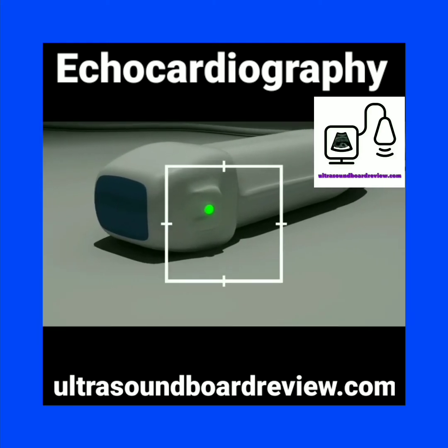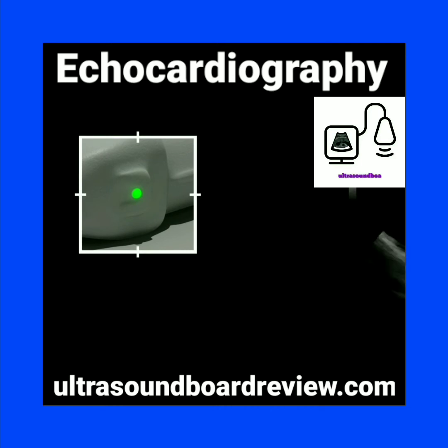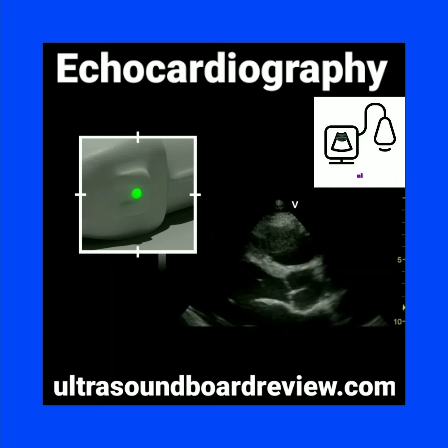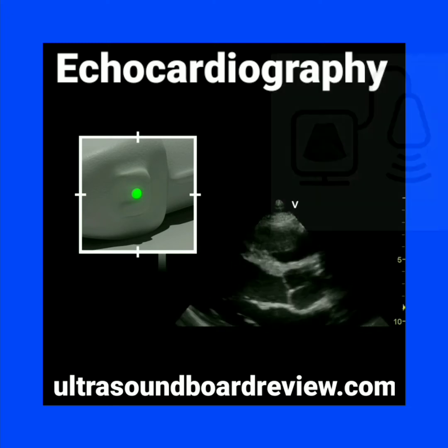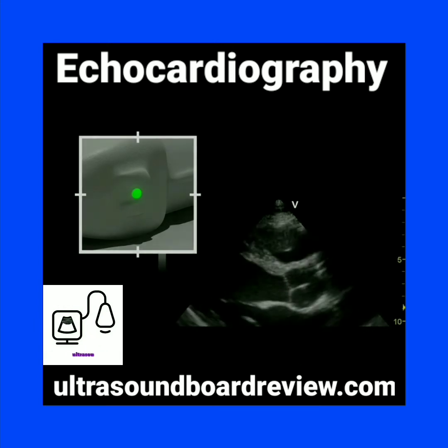Locate the probe orientation marker. The probe orientation marker corresponds with this image orientation marker on the ultrasound display. During cardiac imaging, this image orientation marker should be located to the right of the image. During all other ultrasound applications, this marker will be located to the left of the image by default.